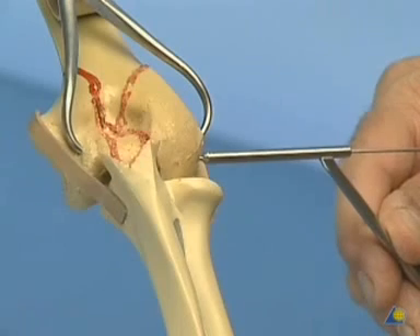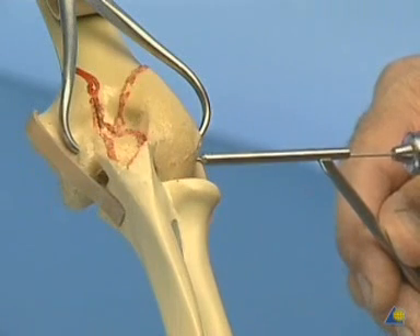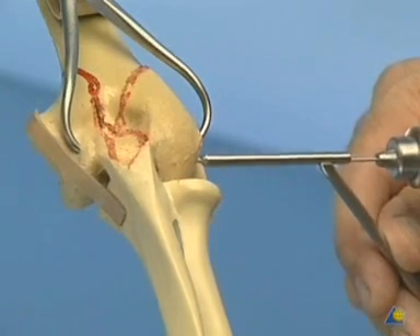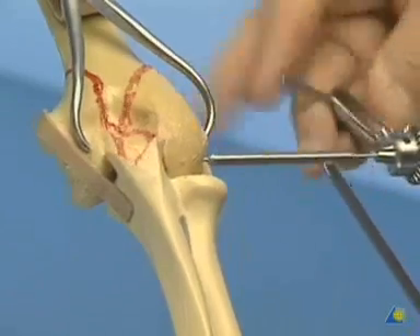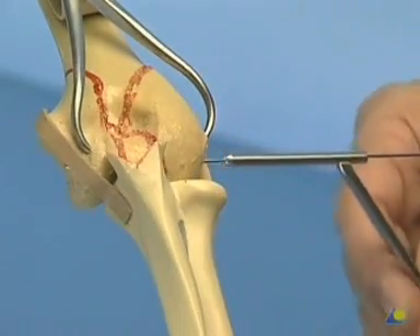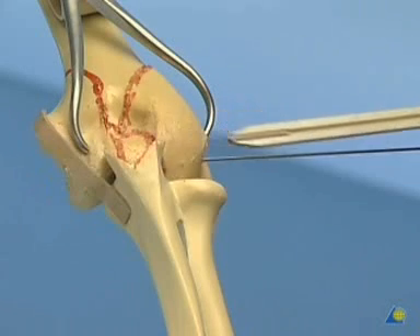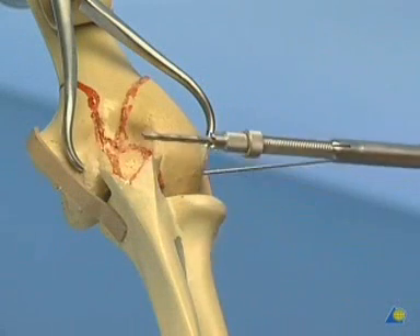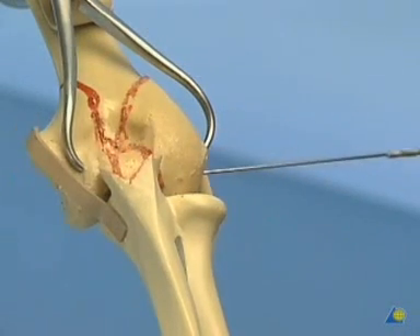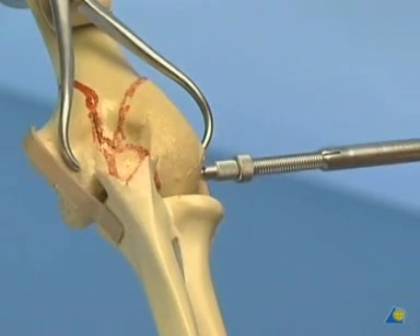The threaded K-wire, which can also serve as a reduction aid, is now drilled in the reverse direction outside-in, all across the three articular fragments. The correct reduction of the fragments, especially their rotation against each other, must be checked because at this point it can still be corrected. The length of the cannulated 3.5 mm cancellous screw is measured with the special measurement device, taking into account the short bit which was cut off. The hole for the screw is prepared with the cannulated drill bit. The special drill sleeve with stop may be adjusted in order not to penetrate too far across, which may lead to loss of reduction or the K-wire being pulled out.